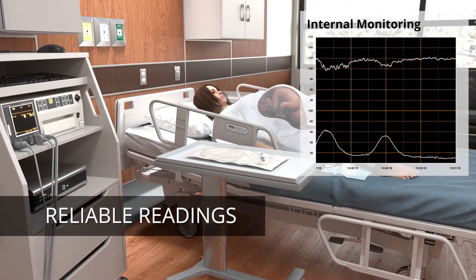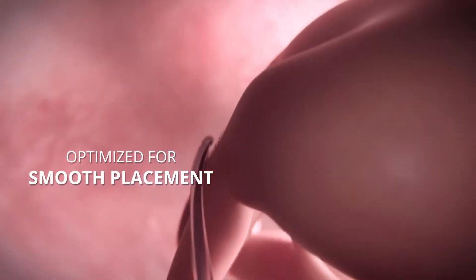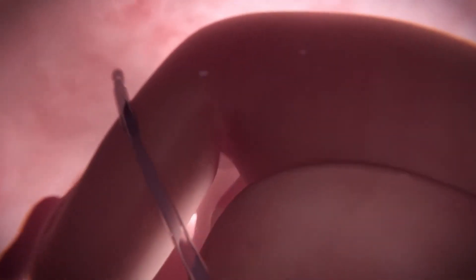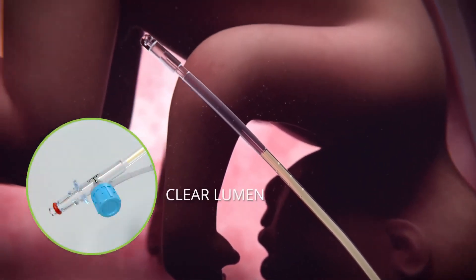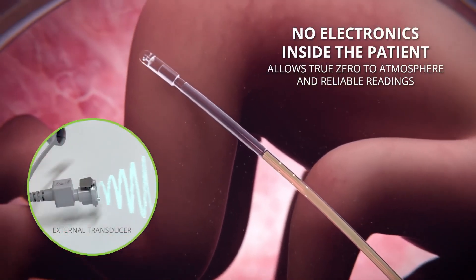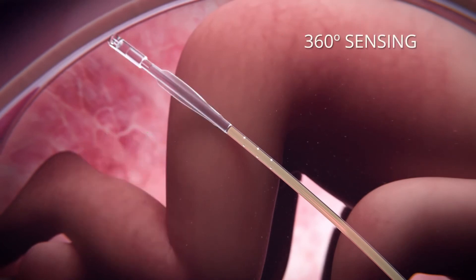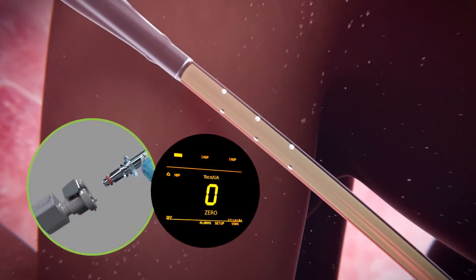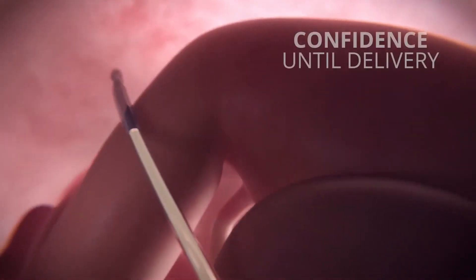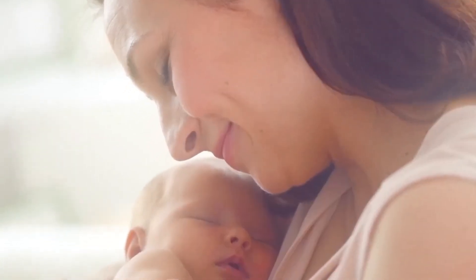The second type of transducer used in measuring intrauterine pressure is the IUP transducer. An intrauterine pressure catheter (IUPC) is a device placed into the amniotic space during labour to measure the strength of uterine contractions. External tocodynometers measure tension across the abdominal wall and detect only contraction frequency and duration. The appearance of contractions by external monitoring may be affected not only by contraction strength but also by maternal habitus, position, gestational age, and monitor location on the abdomen.